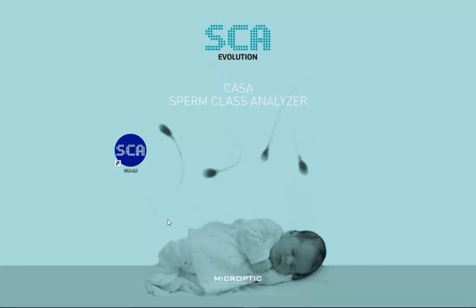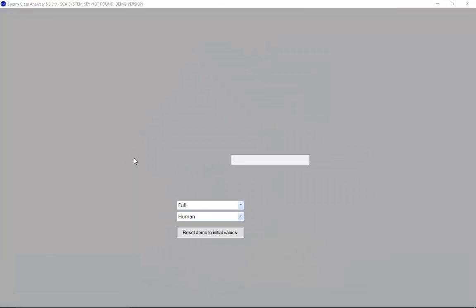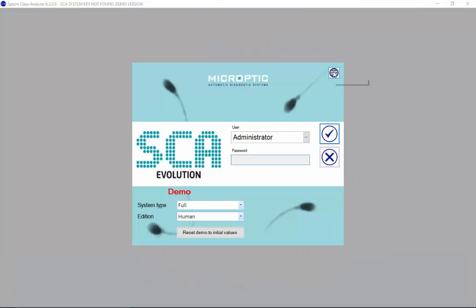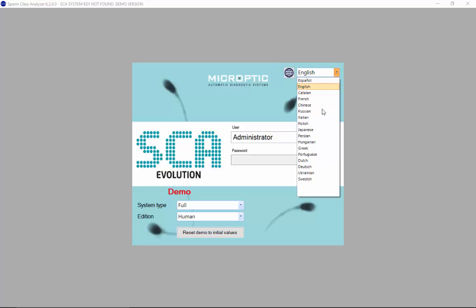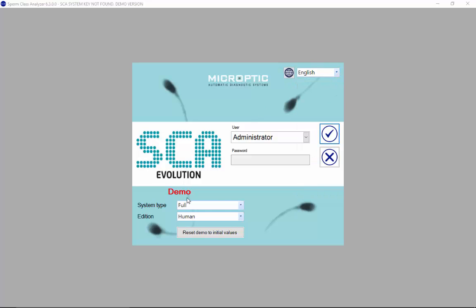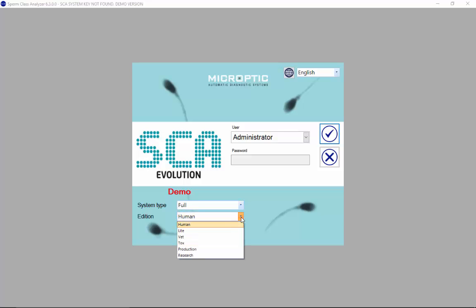Now I will go directly to the program. To start the program — it's SCA 6.3. This version has different languages; there are 16 different languages that you can select. It also has different systems: the full, the capture, the editor, and the viewer.